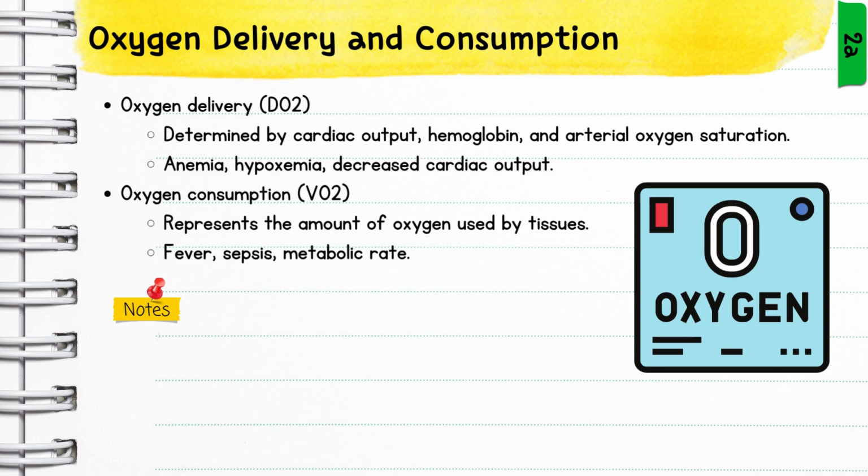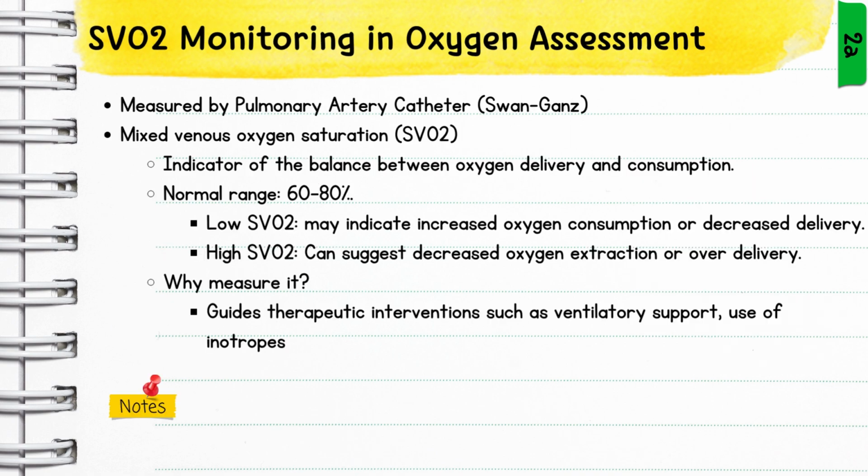Now, how do you get these measurements? A lot of times your monitor will calculate it for you. It's not like a separate thing. It will be up on the screen, but you just need to understand the concepts.